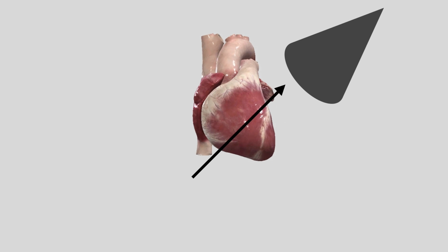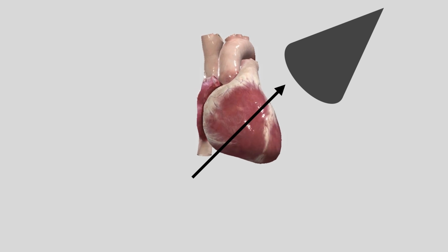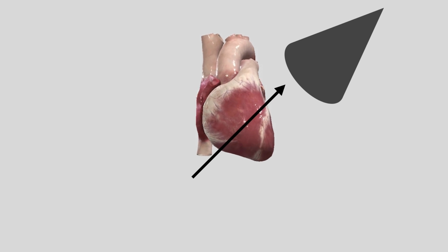When you do your parasternal long axis window, you're already in the right place. You found the window, you found that spot that you can get access to the heart. All you have to do to identify this one is turn your probe 90 degrees. So your probe indicator goes from your right shoulder to your left shoulder, right? So you're going to do an orthogonal view at that spot on the chest wall to find the parasternal short axis window.